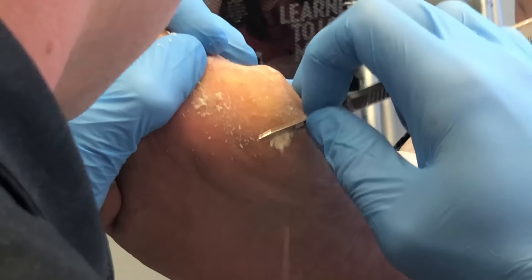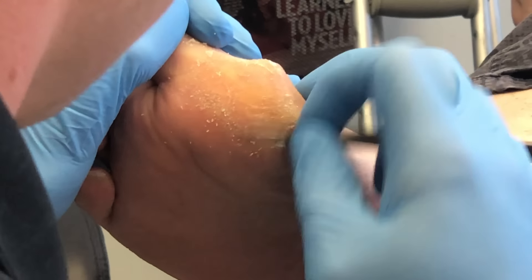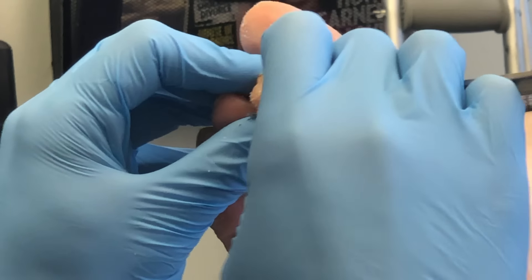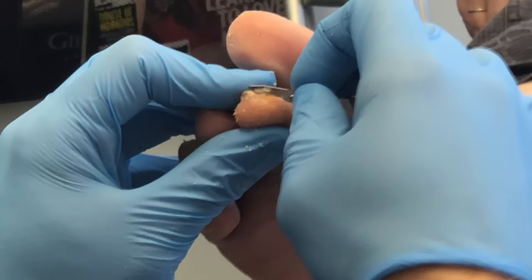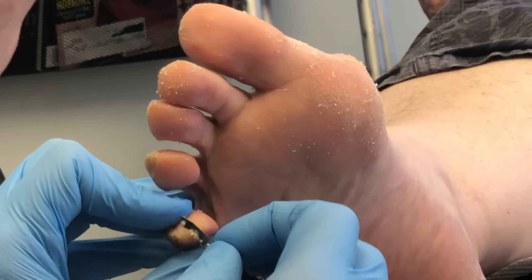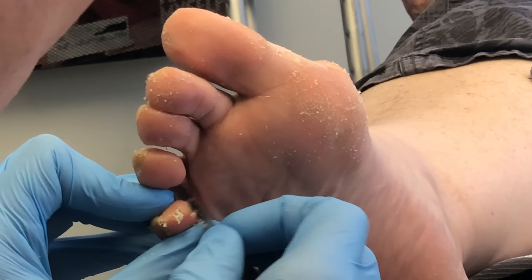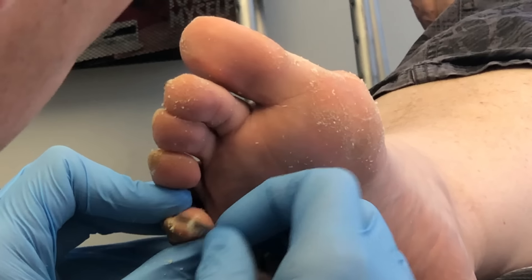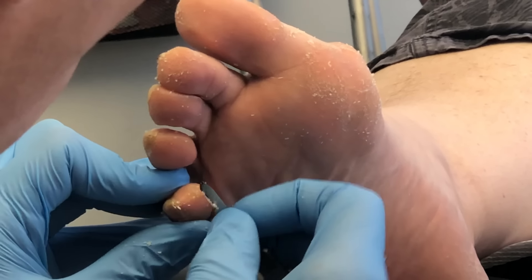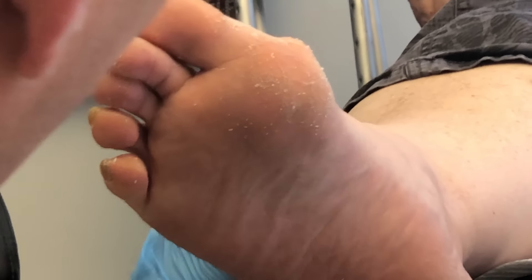Callusing, or hyperkeratosis — meaning more skin than normal — is pressure-related and happens due to pressure. I like to use a 15 blade at the end of the toes and on the smaller tissue just to clean it up a little bit nicer. Again, you want to make sure that you have your anchor points so that when you are debriding you're not going to cut the patient or cause any trauma.